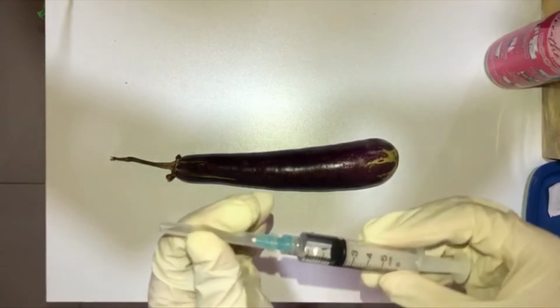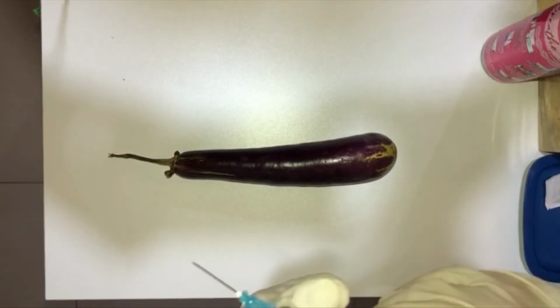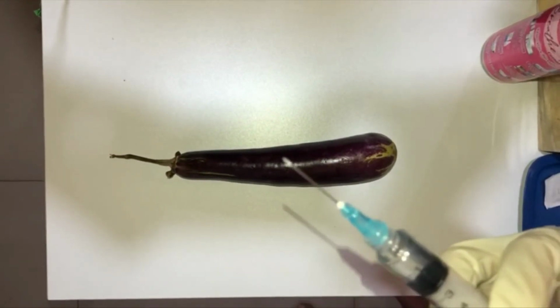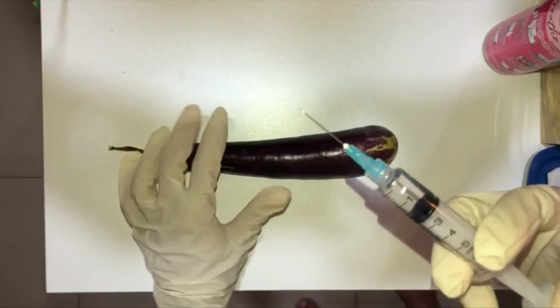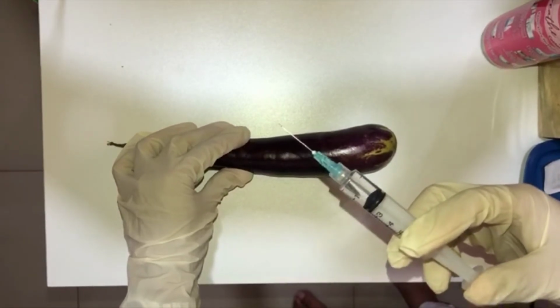Remove the needle cap by pulling straight off. Hold the syringe between the thumb and forefinger of your dominant hand as if you're holding a dart. Insert the needle quickly and firmly at a 45 to 90-degree angle. Release the pinch of the skin.